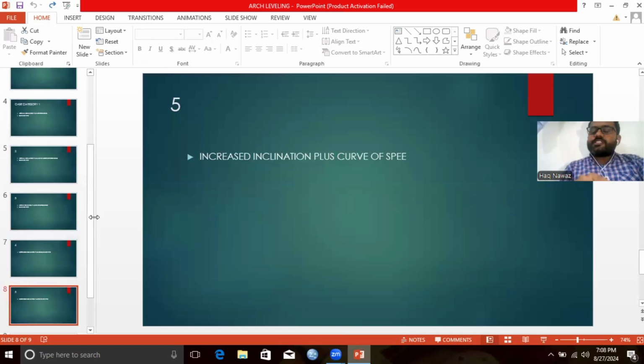The preparation of this category is the same as category 1 patients. We will align our right and left segments and bypass the anterior teeth. Anterior teeth, the incisors, are aligned in a separate segment. Once we reach the heavier wire, 17x25 or 19x25, our arch is ready for retraction plus intrusion. But in these patients, as the magnitude of the vertical problem is greater, there will be greater intrusion required, and only a minor component of incisor retraction will be required.